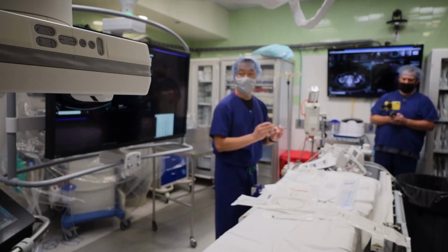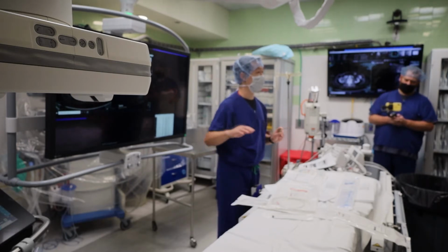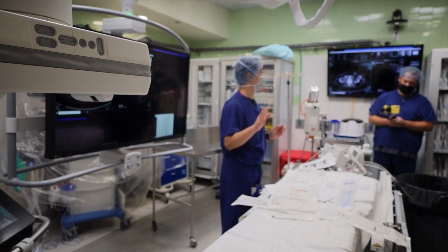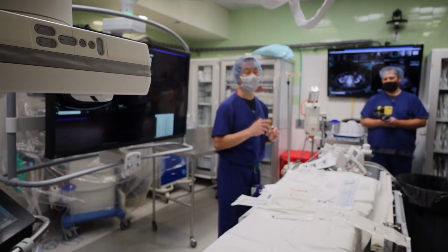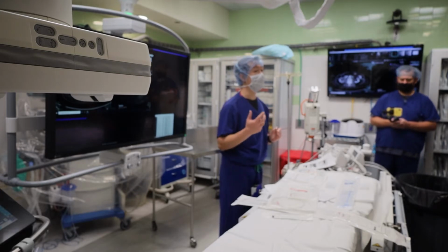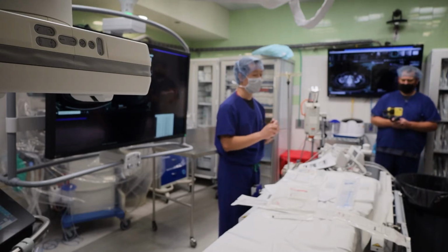Similarly, if you're not in the kidney and you start injecting contrast, the contrast is just going to sit on the screen, and that's what we call a blob fest. After a while, there's so much contrast you can't even see the kidney anymore, and it makes the whole case very, very difficult. So oftentimes when we inject, we use very little contrast, and we're very deliberate about when to use contrast versus just seeing urine come out.